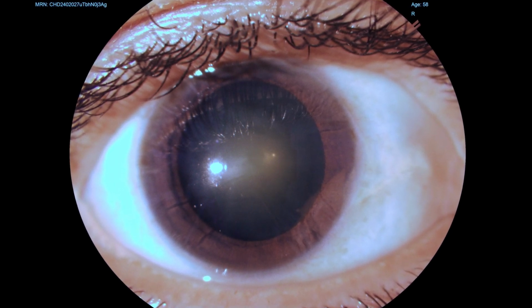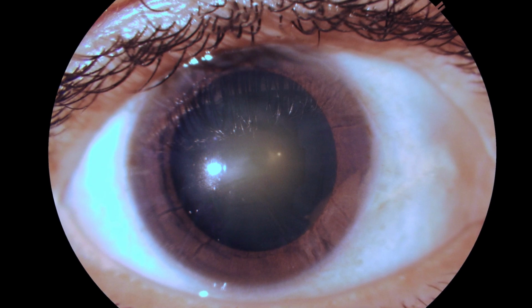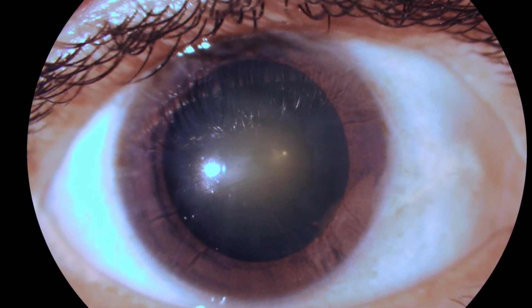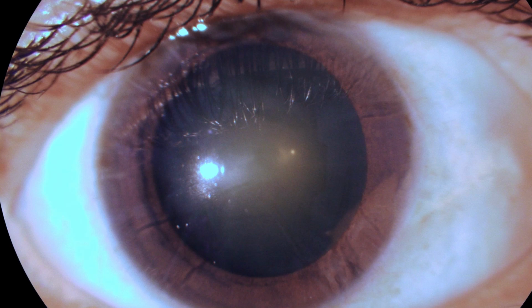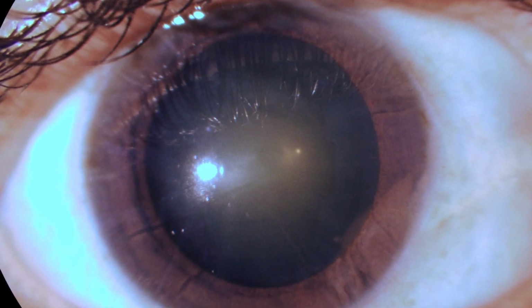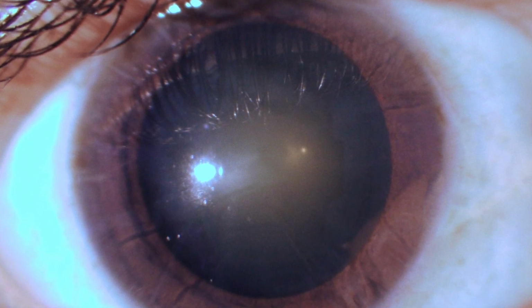This gentleman presented to us with a nuclear cataract in both the eyes, and the complexity was regarding the biometry. This patient had undergone a refractive surgery known as radial keratotomy several years back, nearly 40 years. And now this patient needed a cataract surgery, and for which we have to calculate the IOL power which would be appropriate.